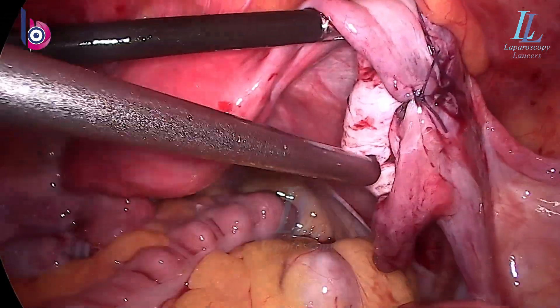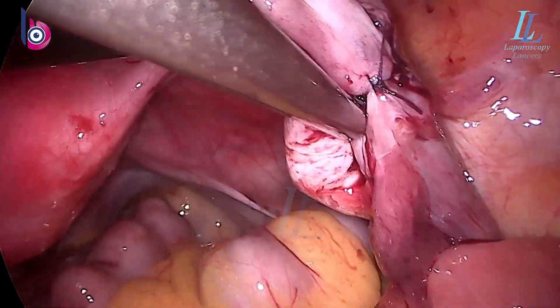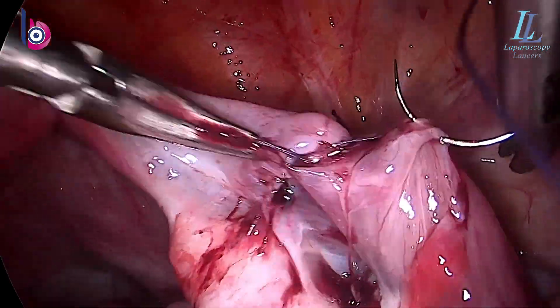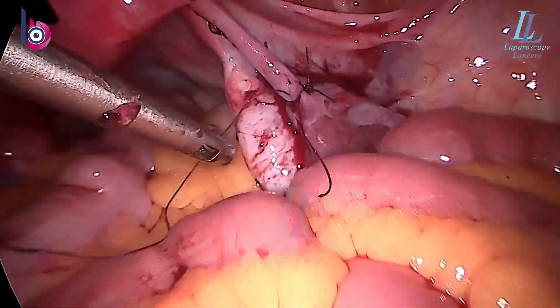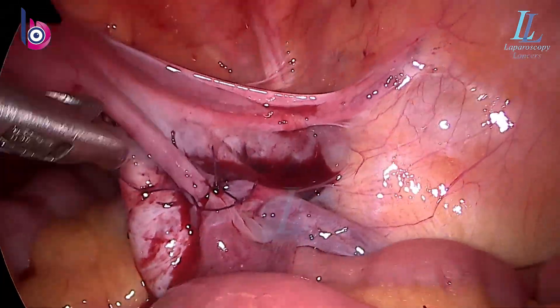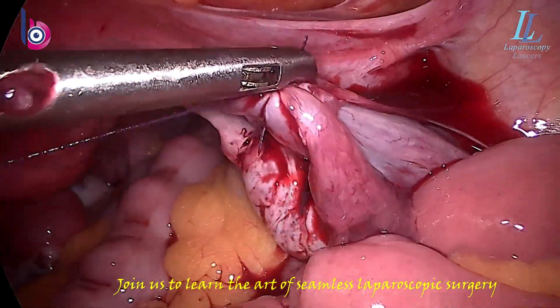Some people use four-zero, five-zero, or even six-zero prolene — that is not required. The only idea is approximating the seromuscular layers, as we are not suturing the mucosal lining of the tube. I'll put one more suture at nine o'clock to complete the anastomosis. This anastomosis is not like a vascular anastomosis; we are just making the seromuscular ends meet. The body will anastomose the mucosal linings by itself — we can't suture inside as we do in pancreatic ducts or vascular sutures. After three sutures in the seromuscular layer and one in the mesosalpinx, the anastomosis is complete.